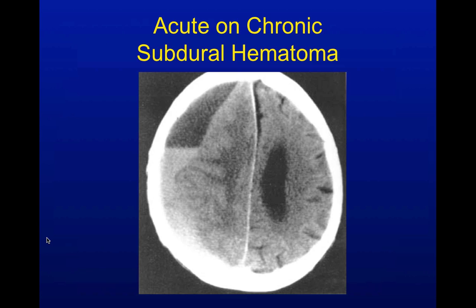We have a chronic subdural hematoma in addition to an acute subdural hematoma — how do we know that? Acute blood is bright white on the CT scan; as soon as it clots, it turns bright white. But clot breaks down over time. The brain stays deformed because that clot's been sitting there so long, so you end up with what's called a cystic hygroma or chronic subdural, which is this black thing. So this guy had a subdural from a fall months or years ago, and now he's bled back into it. Blood layers out because he's been lying with his head back, and when you get the CT scan you see this beautiful meniscus — the blood has layered out and the old subdural's there.